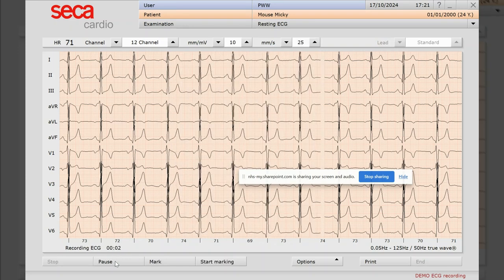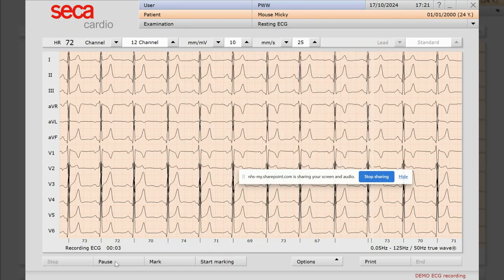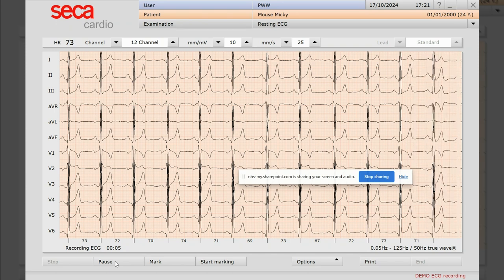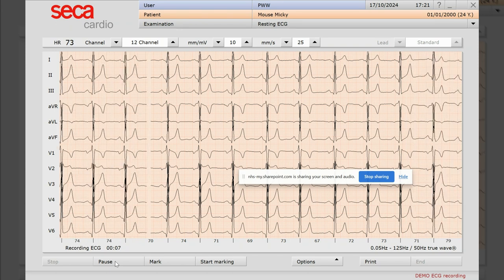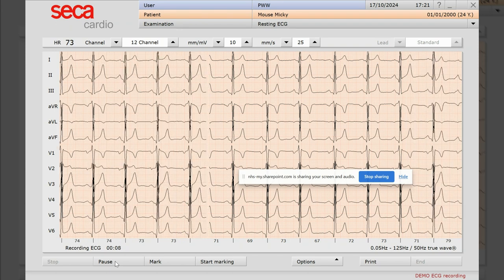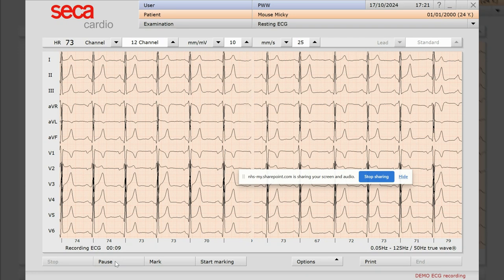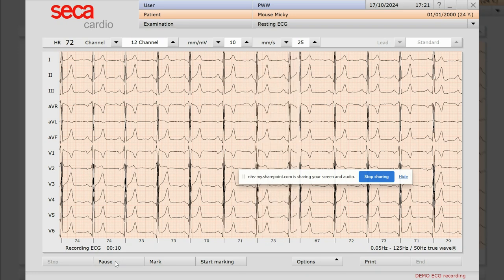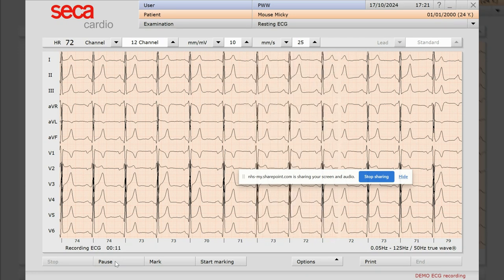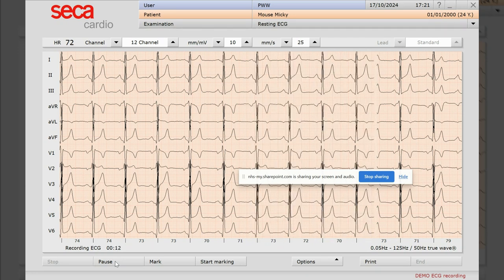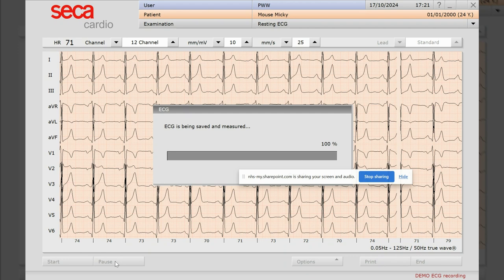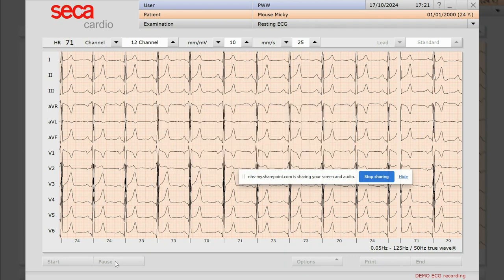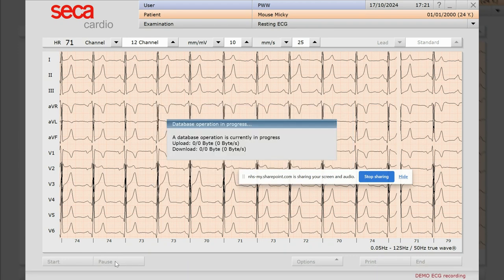And then it's starting to record. It'll record approximately 10 seconds with the ECG, so we'll just wait for that to finish. There you go, it's being saved, adding it into the little database.